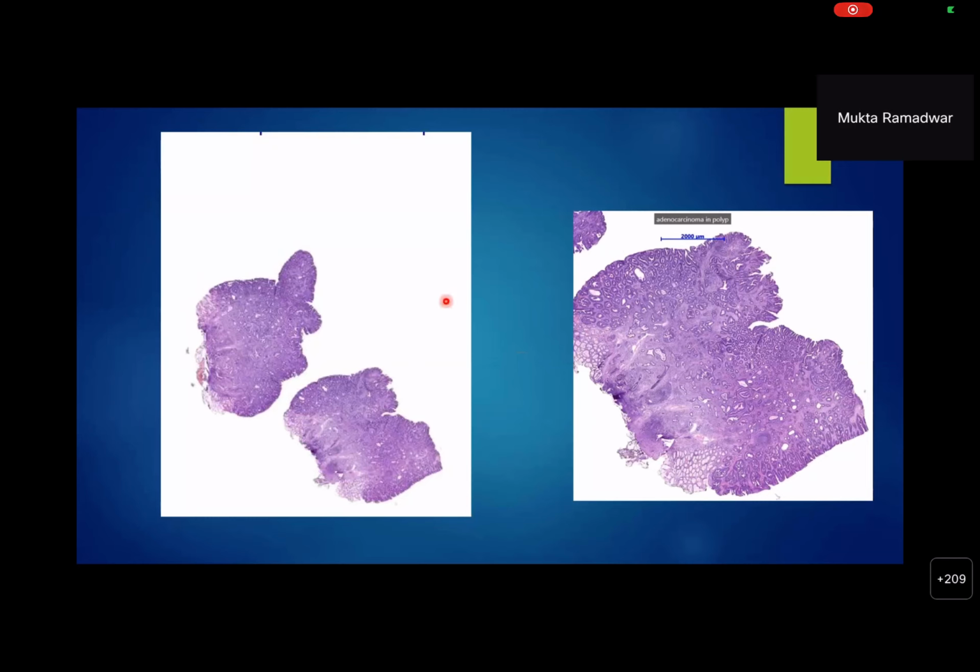So now describe exactly the way we described the earlier so-called polyp, and let's arrive at the diagnosis in a systematic way. Okay. So in picture one, the section shows multiple polypoidal structures without any stalk. There are only two; the polyp has been divided into two and submitted. Yes, you said something important: polypoidal structures without any stalk. Exactly. That's the first big difference between the first case and this case. Yes, ma'am. And it predominantly shows a tubular architecture with a few dilated cyst-like spaces.